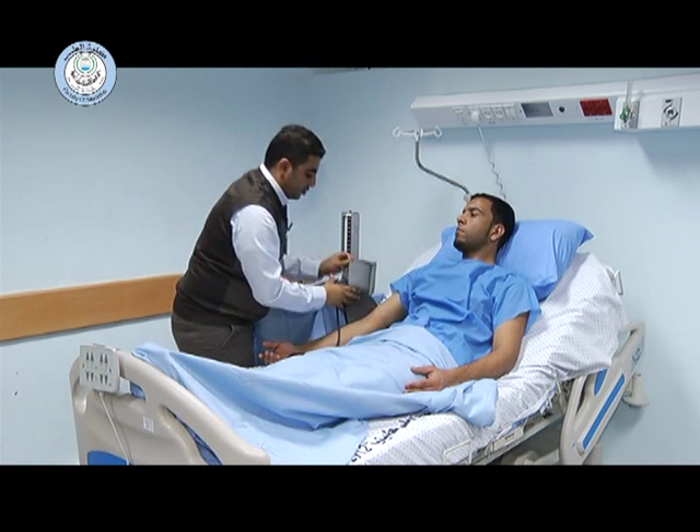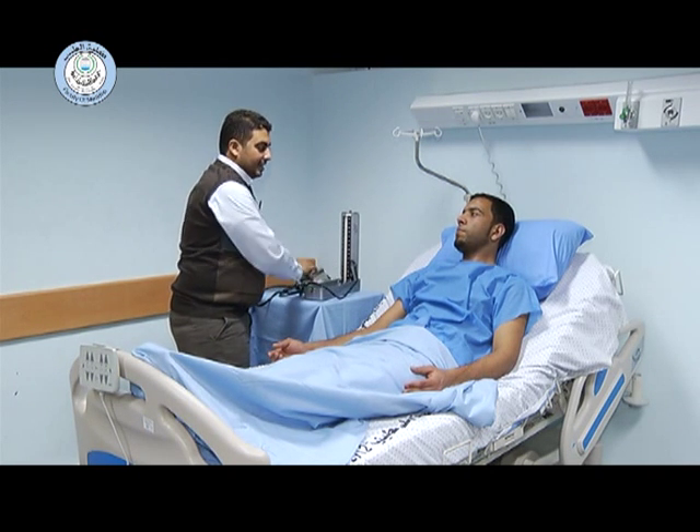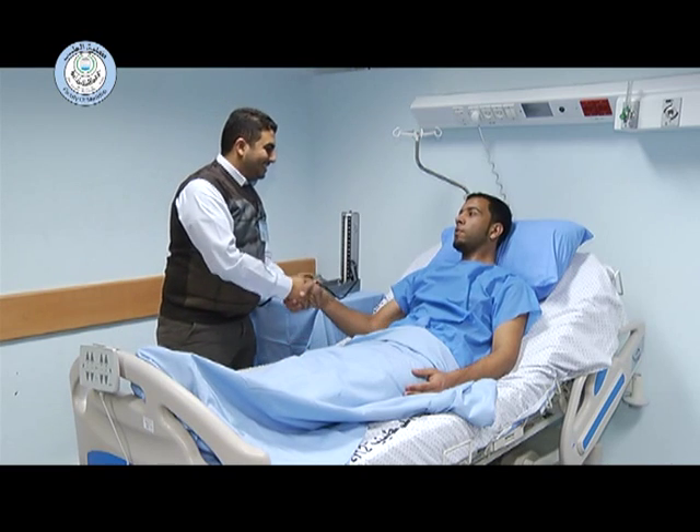After that, we remove the cuff and ensure that the patient is comfortable following the examination. We thank the patient and record the blood pressure measurement.